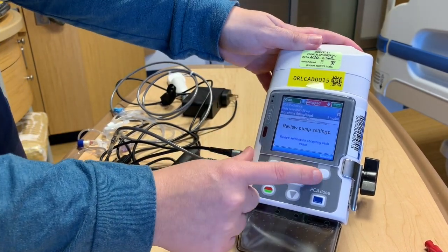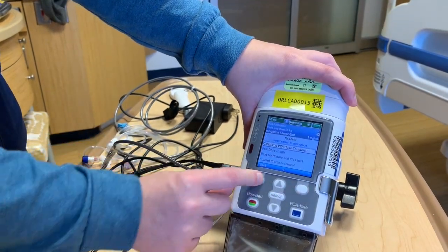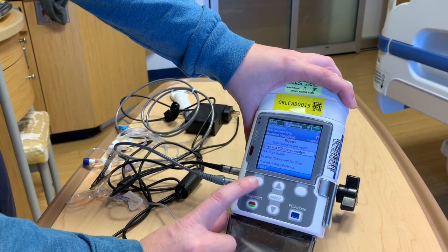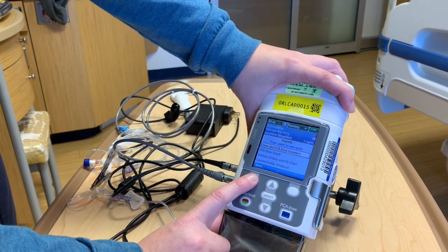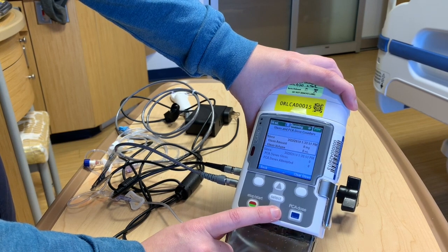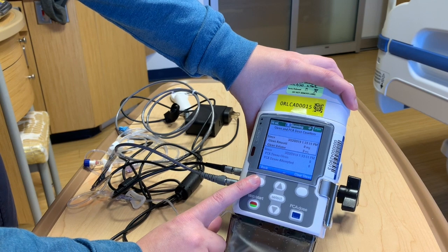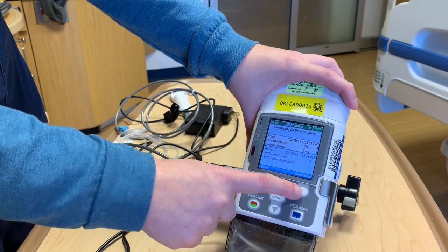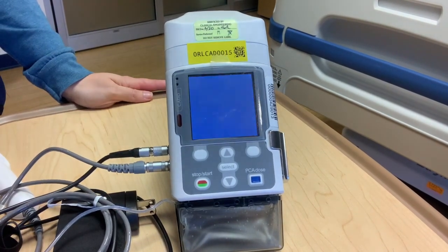If you want to find out reports about how your patient is doing, push reports and you can select this. It's going to show you the amount given, the given volume, how many doses were attempted, and how many were actually given. You can also go over here if you wanted to and clear the given doses. Thank you for joining us for this CAD PCA pump video.